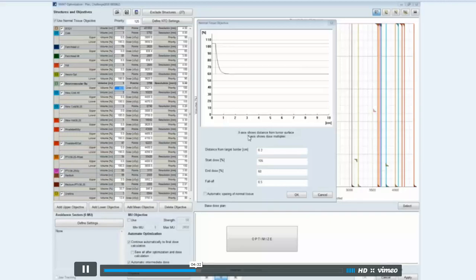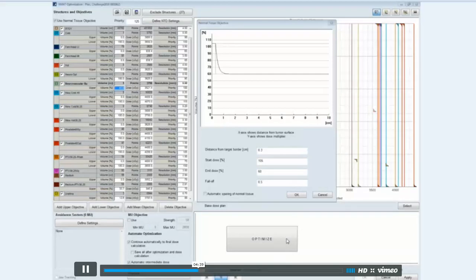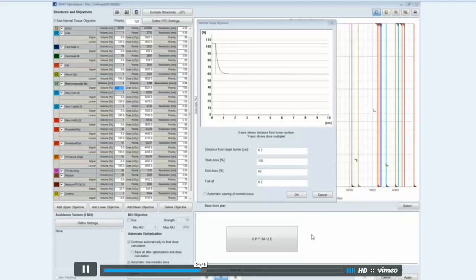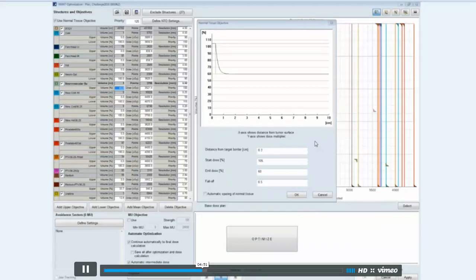After that, that is when I evaluated and created cold and hot structures to fill in any gaps or remove any spillage outside the PTV. What did you get when you first ran through them, your original score? It was pretty low compared to what I got on the last run, I think 140.